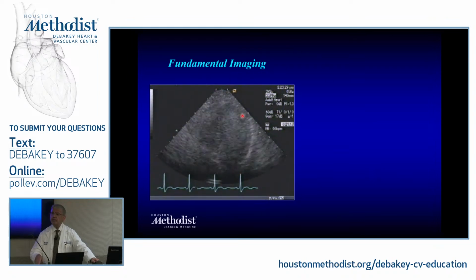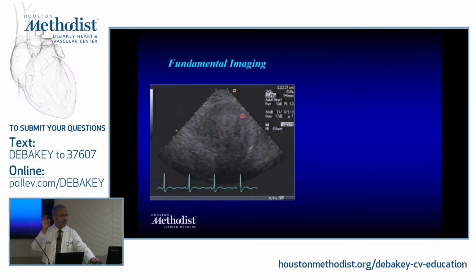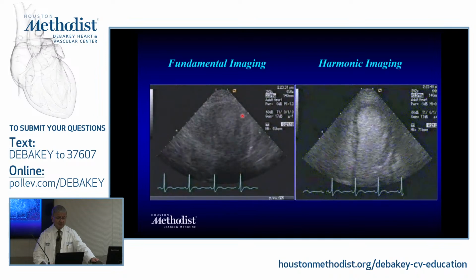So let's say I'm sending with a 2.5 megahertz transducer, and I'm listening at 2.5, the same. What do you see? You see that I cannot differentiate well between contrast and myocardium. They're all kind of blurred, right? So this is the same patient, just with a flip of harmonic imaging versus fundamental imaging.